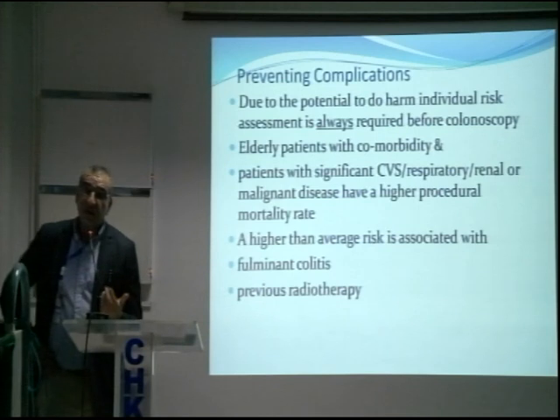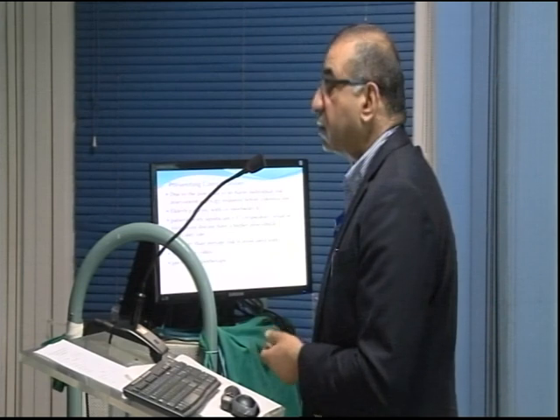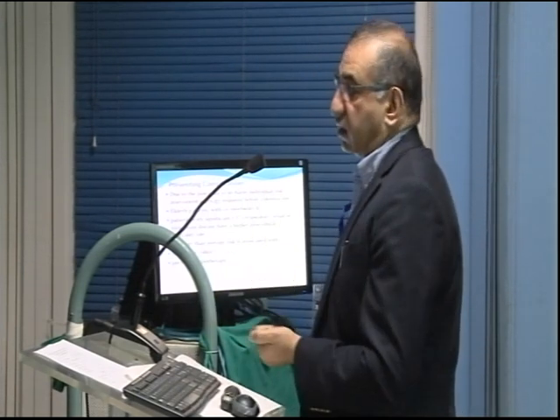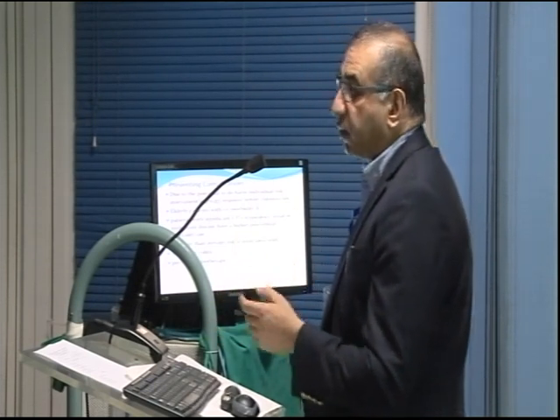A common scenario is a patient who has had radiation for prostate cancer, comes in with rectal bleeding, they have post-radiation colitis, and we do APC in those patients. In those patients, try not to do retroflexion in the rectum. Do not do retroflexion in the rectum in patients with severe colitis, because those are the cases where you will cause a perforation.